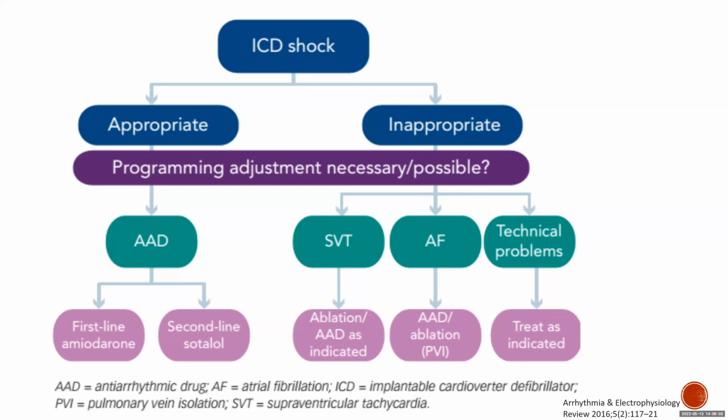In case of VT storm with very frequent shocks, is it better to put a magnet or let the device deliver it? Yeah, that's a good question, Abdul Mohsen. It's really a clinical judgment. The advantage of putting a magnet and you controlling shocks, you save battery. That's one thing. Two, sometimes patient can have VT, but the patient is awake. The device doesn't know that, you do. So you wouldn't give shock when the patient is awake. You'll give sedation or give amiodarone and wait a little bit and so on.